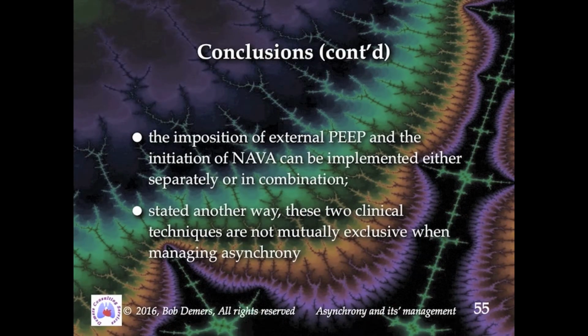Therapists who provide direct patient care to mechanically ventilated patients are well advised to acquire a thorough knowledge of ventilator asynchrony due to its high incidence and because of the enormous energy deficit which it imposes upon those patients who present with it.